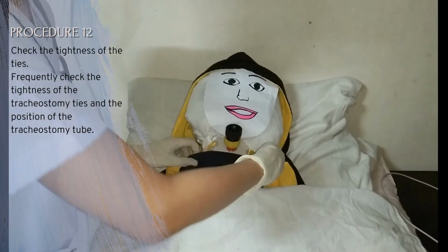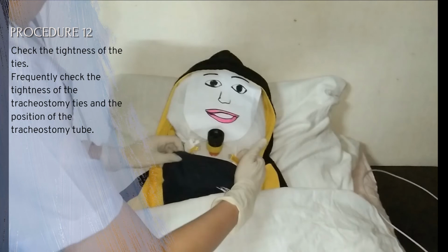Check the tightness of the ties. Swelling of the neck may cause the ties to become too tight, interfering with coughing and circulation. Ties can loosen in restless clients, allowing the tracheostomy tube to extrude from the stoma.